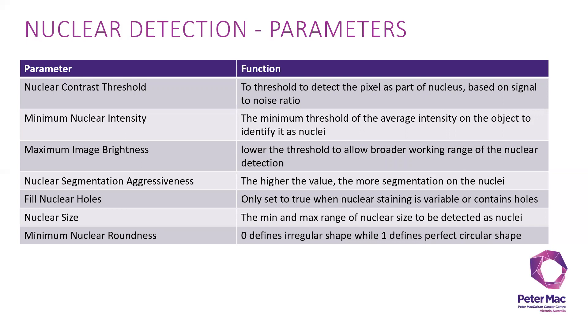You can adjust the maximum image brightness to allow the broader working range of the nuclear detection. You can increase the segmentation aggressiveness to have more segmentation on the nuclei. You can set the fill nuclear holes function if you have variable nuclear staining or holes in the nuclear staining that would allow detection of multiple nuclei rather than single nuclei.